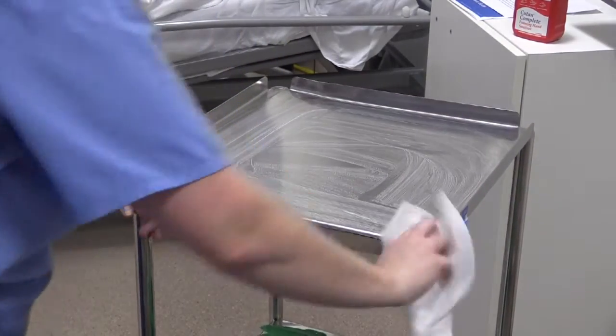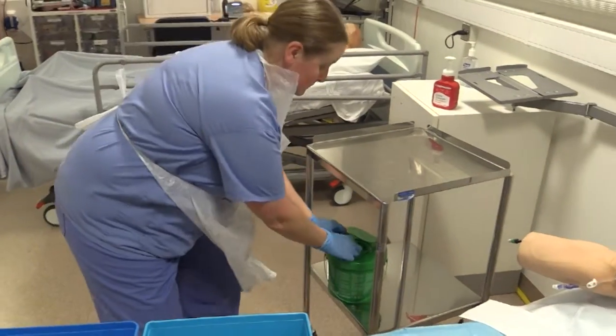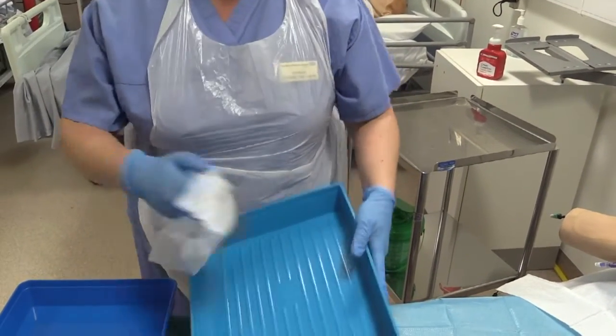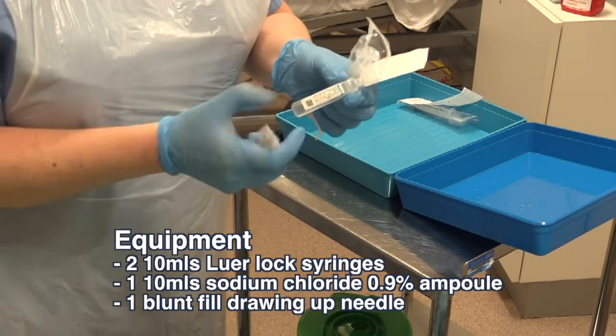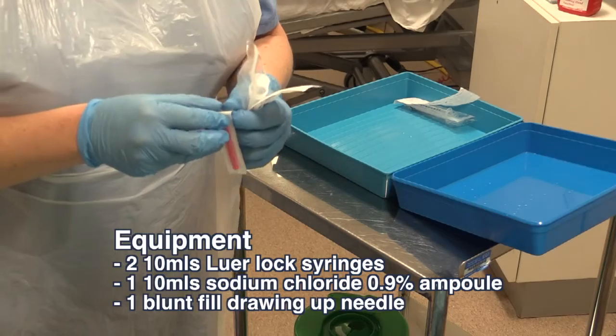Clean the trolley with a Clinell wipe, then apply apron and gloves. Clean two blue trays with a Clinell wipe or suitable alternatives in the community setting. Prepare all the equipment using aseptic non-touch technique. You will need: two 10ml Luer lock syringes, one ampoule of 10ml normal saline, and one blunt fill needle.